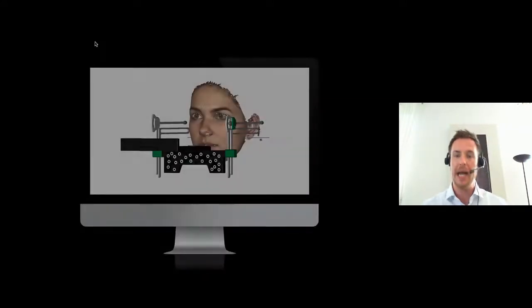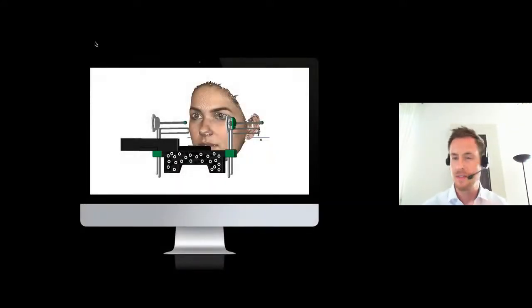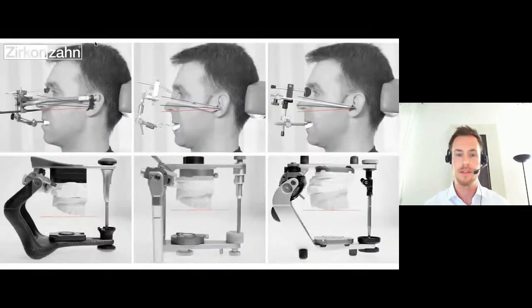Well, if we are done with the intraoral scan, and this is our working base, it has to be accurate, and you're able to work digitally in any kind of case. From my experience right now, also for full arches, it's not a problem at all when you know the protocol and the steps in between. And one of those steps is the registration process of the patient information itself.